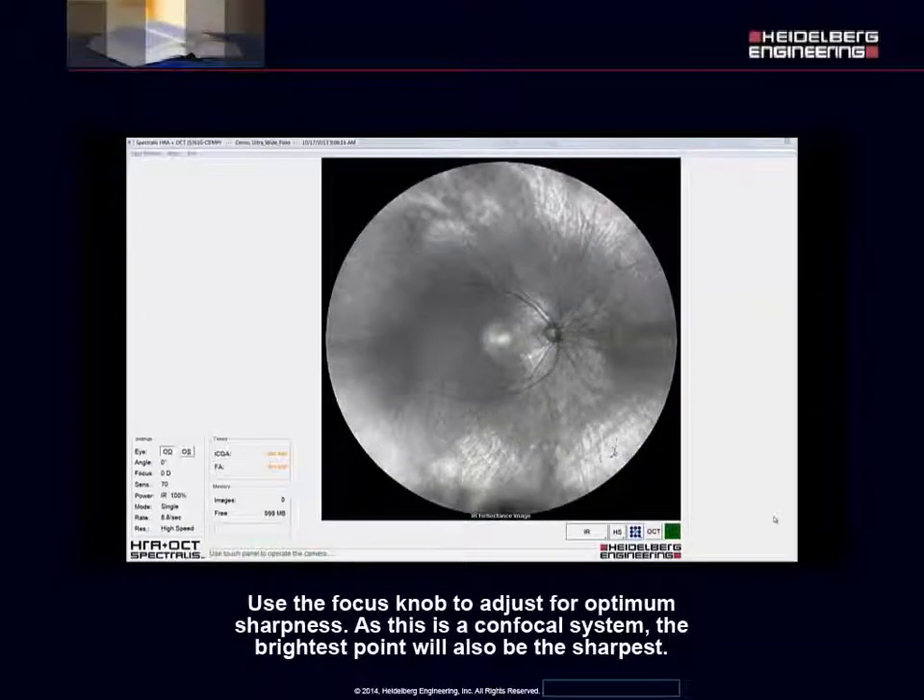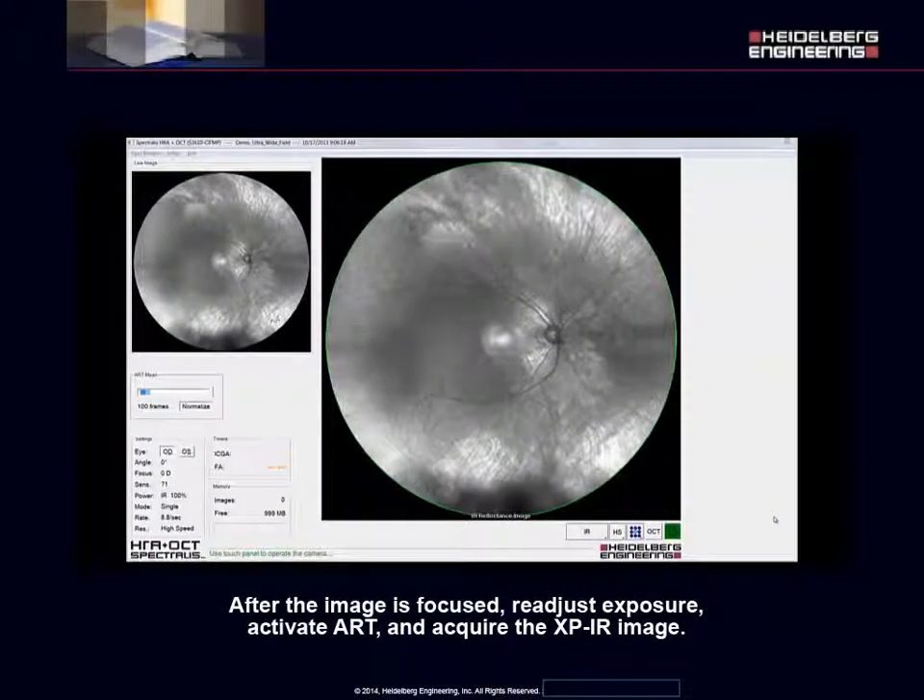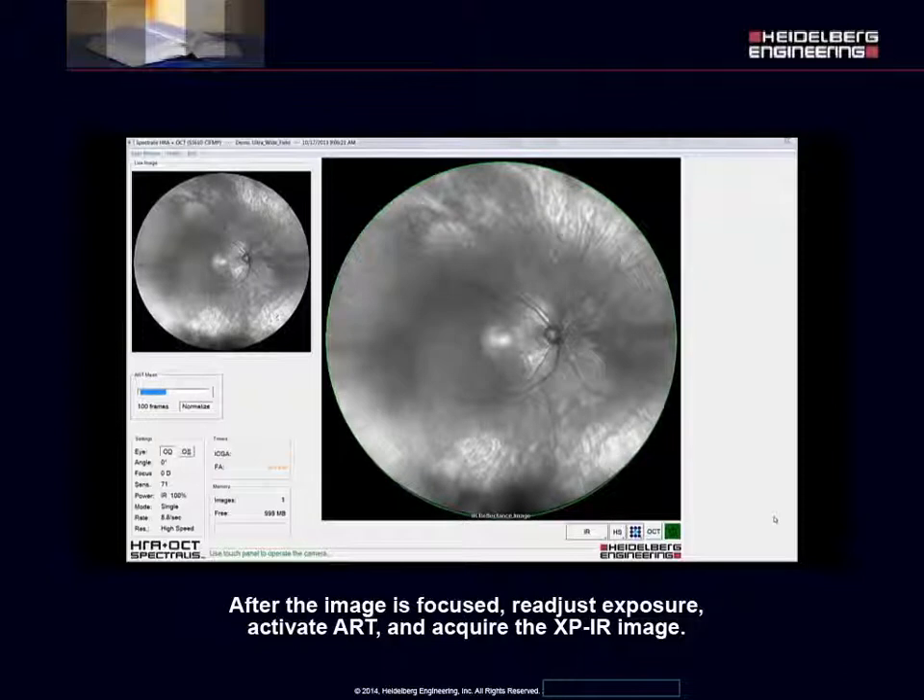Use the focus knob to adjust for optimum sharpness. As this is a confocal system, the brightest point will also be the sharpest. After the image is focused, readjust exposure, activate ART, and acquire the XPIR image.